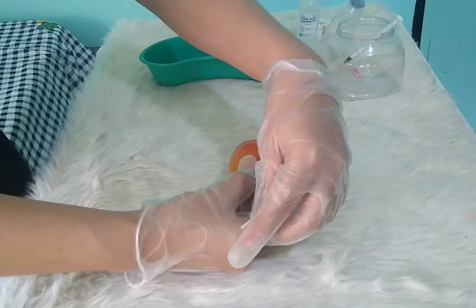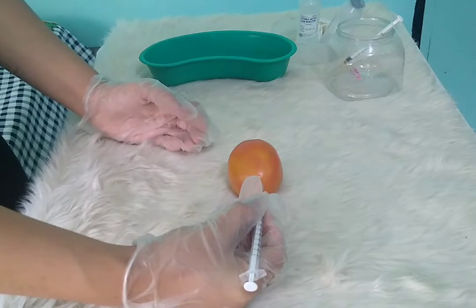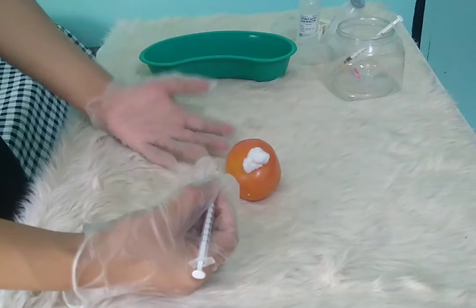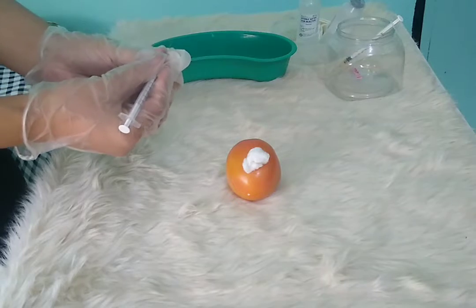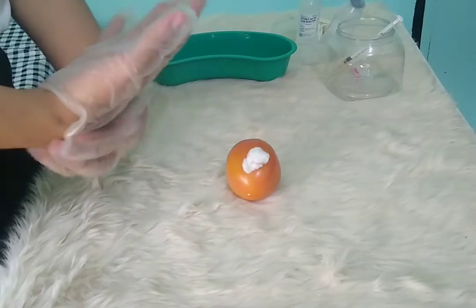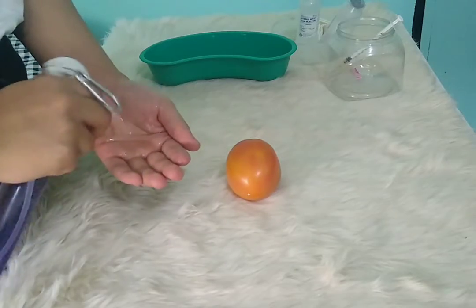Withdraw the needle quickly at the same angle that it was inserted, activate the needle safety, and apply a bandage if indicated. And then do not massage the area. And then we can dispose of the syringe and needle into a sharps container. And then we can remove and dispose of the gloves and perform hand hygiene.